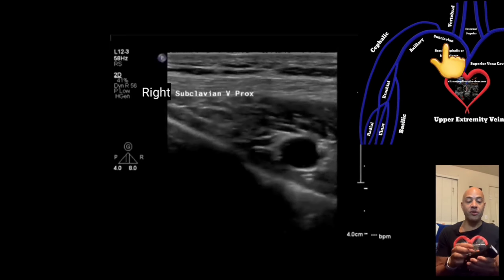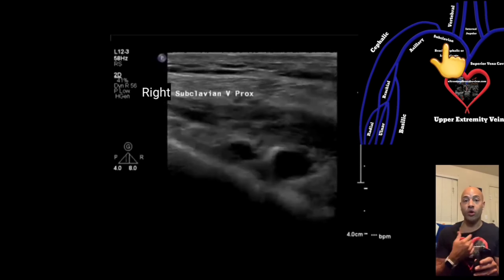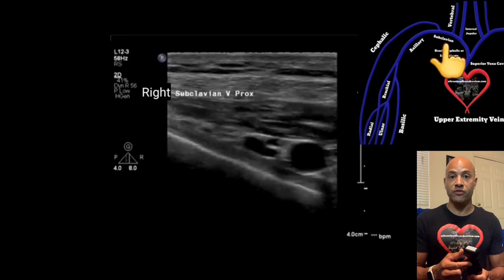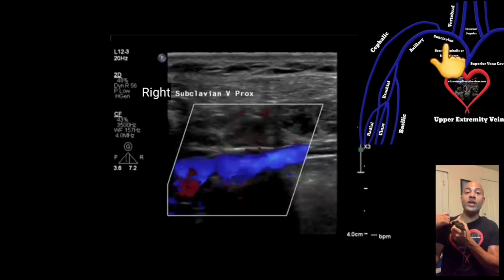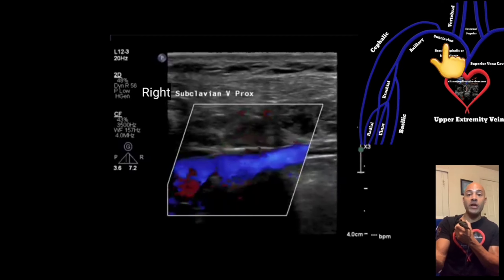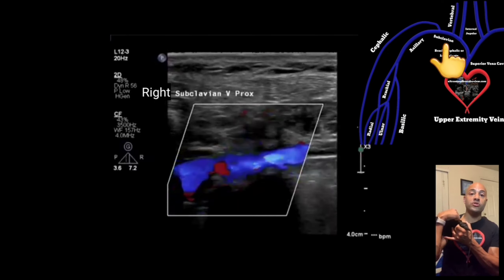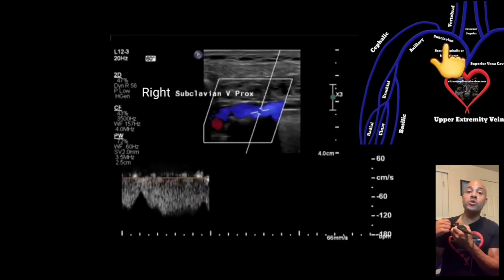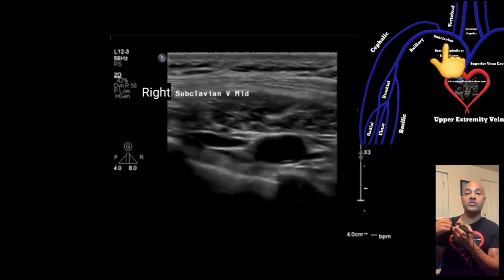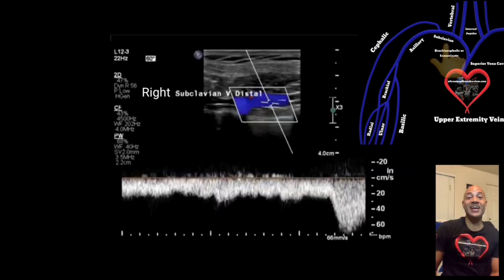From here on out, make sure your index is pointed towards the patient's right side no matter which side you're working on — unless you're recording transverse views, in which case your index will be 90 degrees to your sagittal views. Turn on color and acquire an image while augmenting the patient's lower arm to show there are no major obstructions between where you augment and your transducer. Then turn on pulse wave and acquire spectral Doppler waveforms showing augmentation from the patient's forearm. Repeat these steps for the mid and distal subclavian vein.